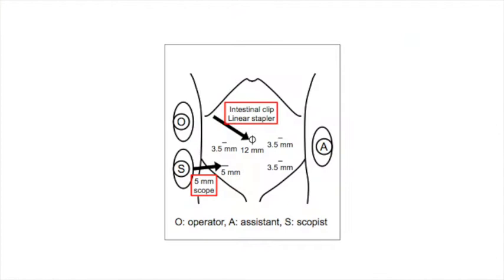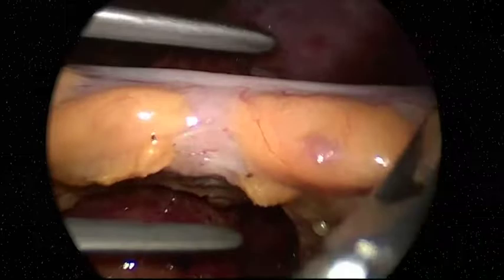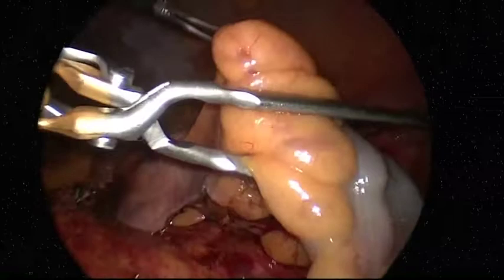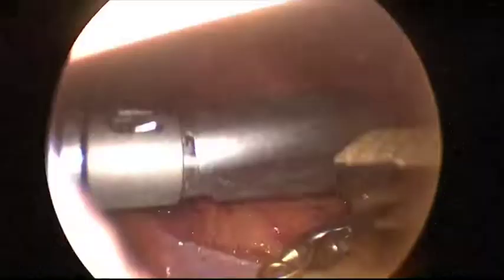A 5 mm scope is inserted through the right lower 5 mm port, and forceps, an intestinal clip, and an articulated type linear stapler are inserted through the 12 mm port for colonic transection. An intestinal clip is placed at the oral side of the colonic cut line. The angle of the clip can be adjusted using an angle adjuster, and the angle of the end linear stapler can be changed as well.